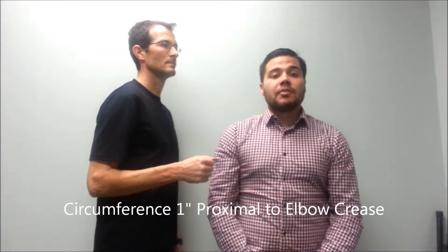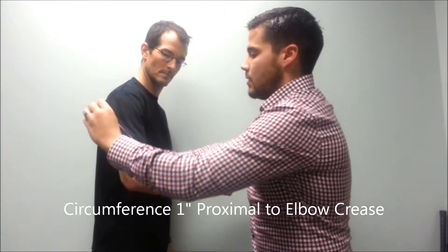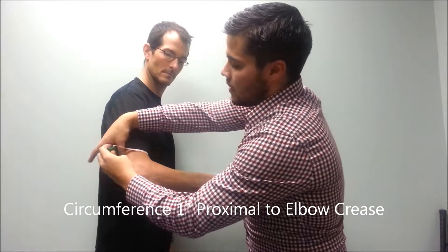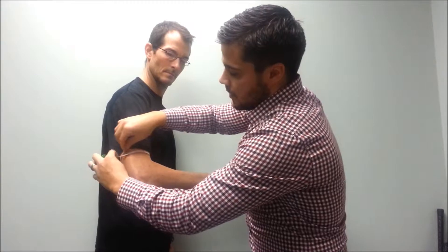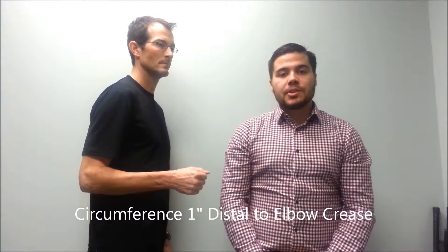Next we need a circumference one inch proximal to the elbow crease. Next will be a forearm circumference one inch distal to the elbow crease.